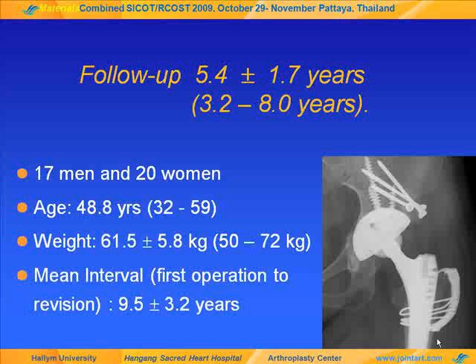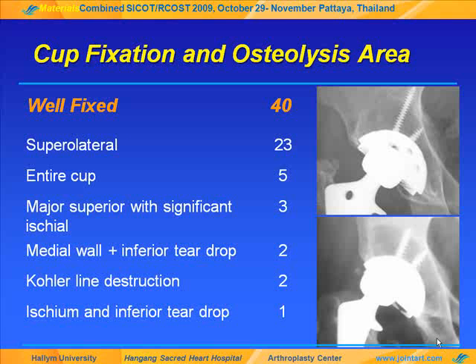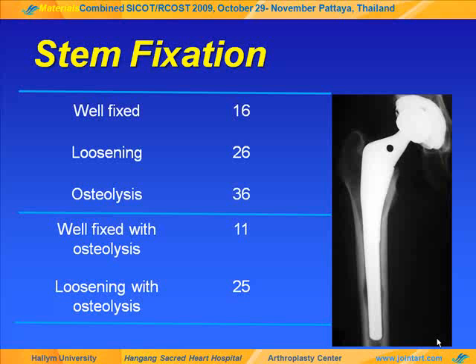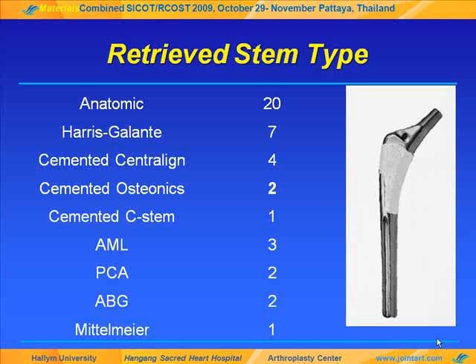The most common pre-op diagnosis was osteonecrosis of the femoral head. As causes of revision, retroacetabular osteolysis was observed in 36 hips and stem loosening in 26 hips. Among them, 40 cups were well fixed and pelvic osteolysis was most frequently observed in the superolateral area. Femoral osteolysis was observed in 36 hips. The majority of the retrieved cups were Harris-Galante cups with average cup size of 55.2 millimeter. The most common retrieved stem was an anatomic stem.